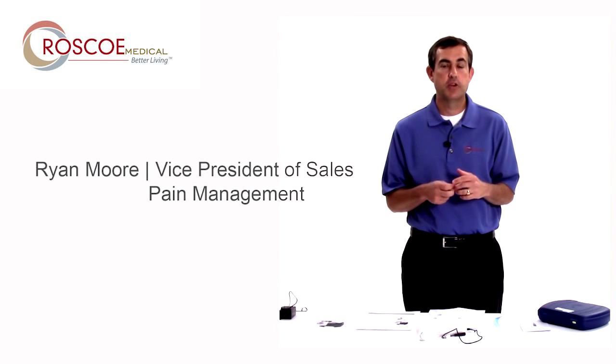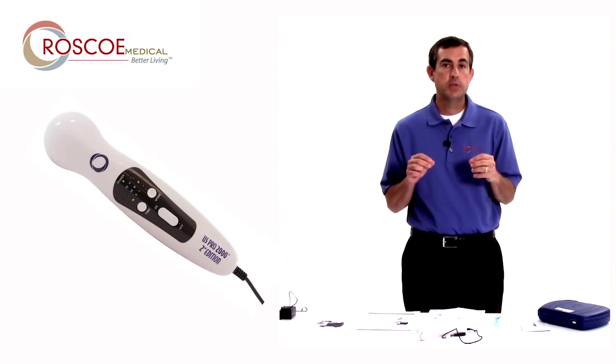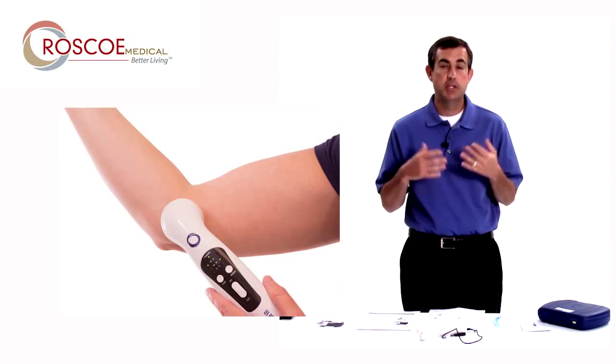Hello everyone, it's Ryan with Roscoe Medical. Hope everyone's doing great. Very excited to tell you about a new product we have today. Our US Pro 2000, the first edition, was a very popular portable ultrasound unit. People loved its reliability and its portability.